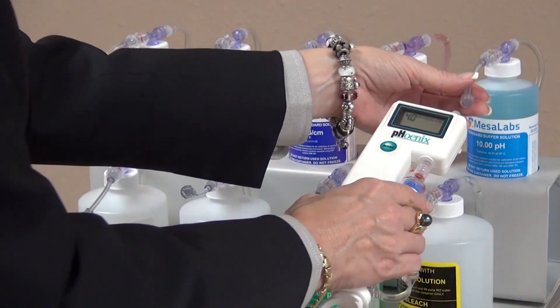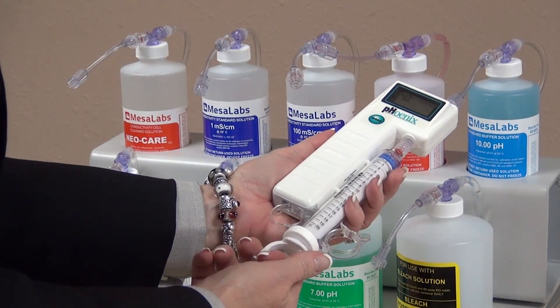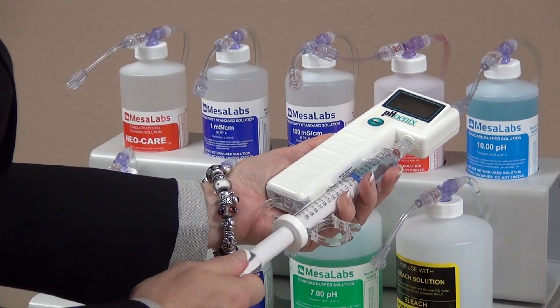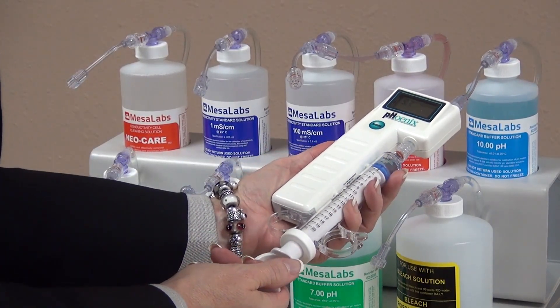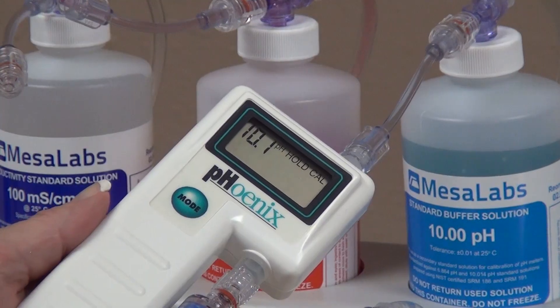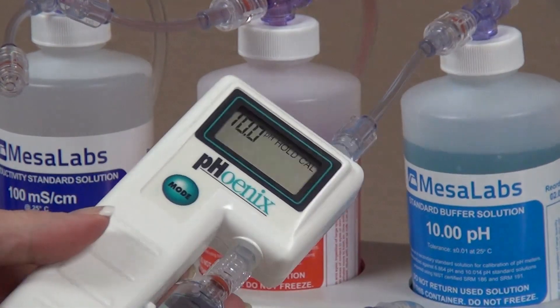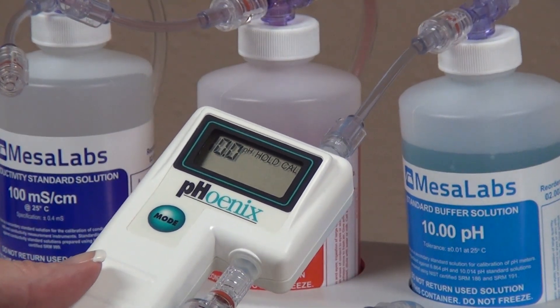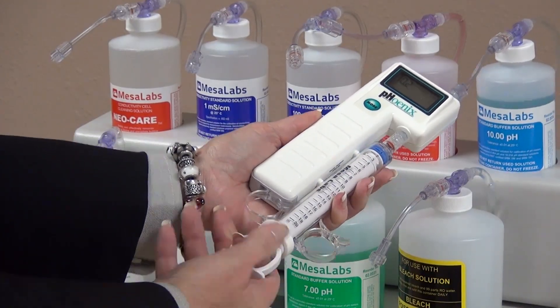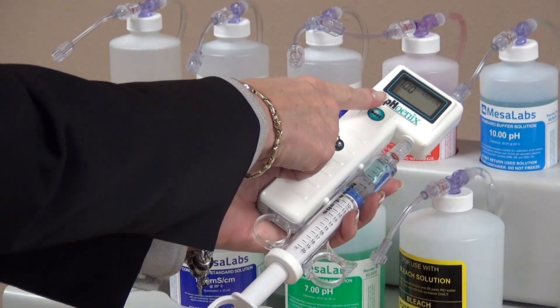Next, connect your Phoenix Meter to the 10.0 pH buffer solution. Initially flush through the cell to remove the 4.0 pH, then draw solution through the syringe until it is one-third to one-half full. When the reading stabilizes, press the up or down switch once and the meter will automatically snap to 10.0 pH. Expel the solution, then draw fresh solution to confirm the accuracy of the displayed reading, which is 10.0 pH.